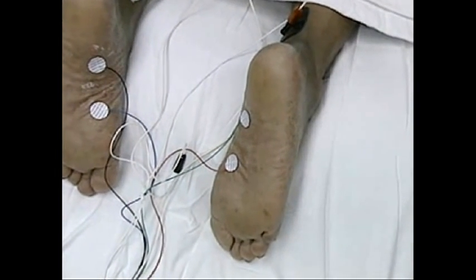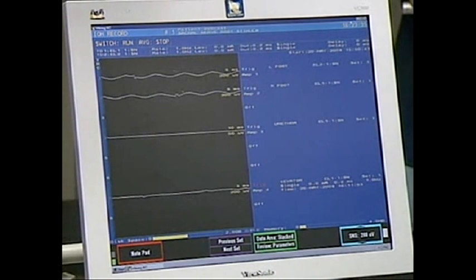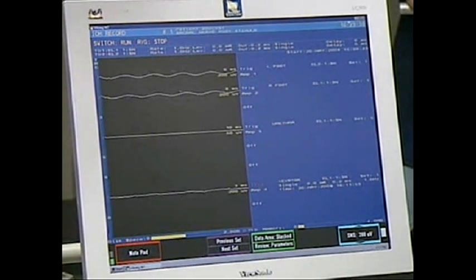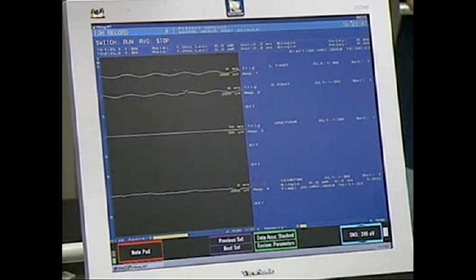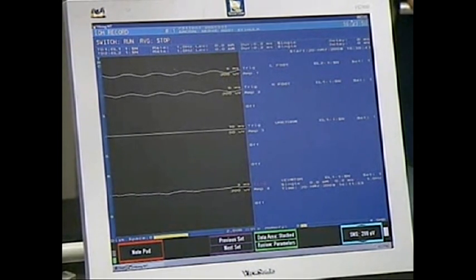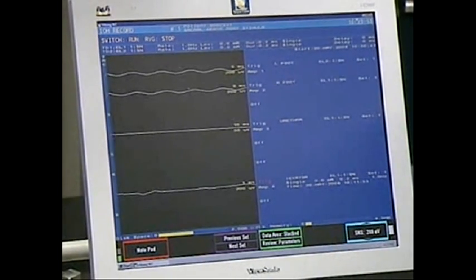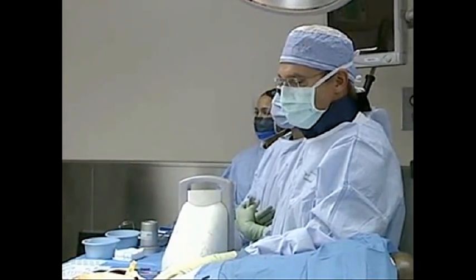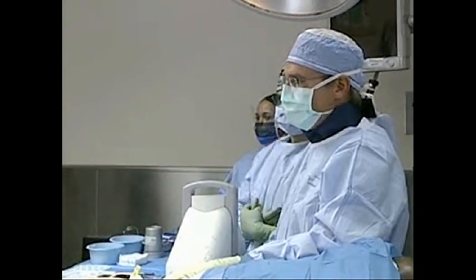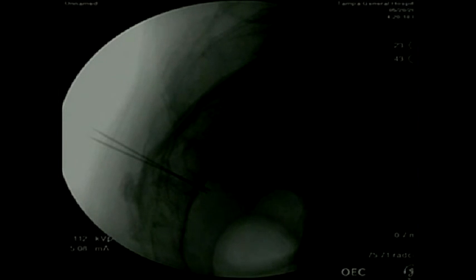We're going to go ahead and lower the stimulus now. This is also telling me that the right S3 foramen is not going to be terribly helpful. We're all wired a little bit differently, but trying to stimulate through that right S3 foramen, we would get an undesirable response in terms of leg motion and, more importantly, probably a lack of efficacy on that side. So in terms of left versus right, clearly my first stimulus on the left was helpful. This may give us some glimpse into the pathology for this particular patient — he's having issues with urinary retention as well as urgency, frequency, and urge incontinence, which are indications for using the InterStim.